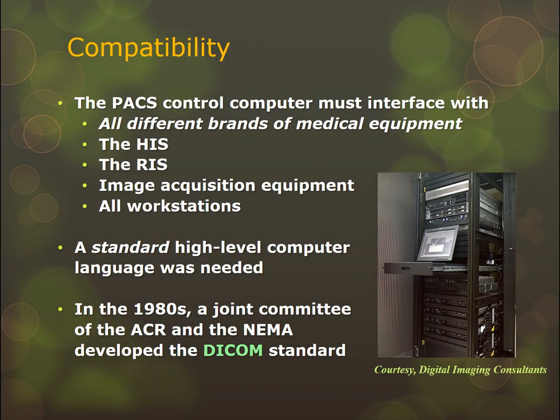So the PACS control computer must interface with all different brands of medical equipment. Like I talked about, the control computer sits at the very heart. It talks to the HIS, the RIS, the acquisition workstations, everything. A standard high-level computer language was needed to make this work. So way back, before any of you were born probably, in the 80s, we had all these different systems, HIS, RIS, all these different types of modalities, GE, Philips. Nobody could talk to anybody. You couldn't make them work together. And so in the 1980s, a joint committee of the ACR and NEMA developed the DICOM Standard. And it gave us the standard high-level computer language to be able to make them all work together.